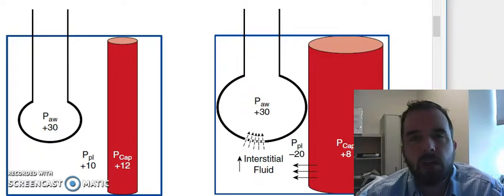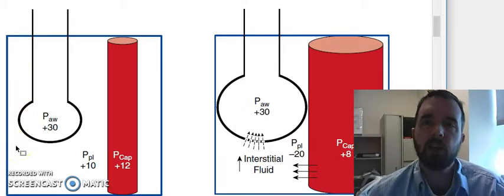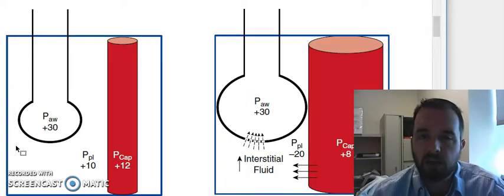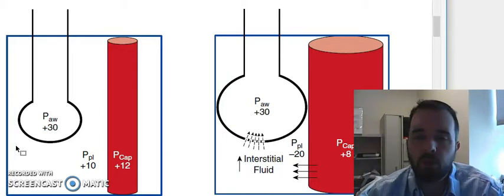I wanted to show you this concept about why mechanical ventilation is different than normal breathing. When we breathe normally, we actually suck air into our lungs. We generate a negative intrapleural pressure, okay? And air enters our lungs in that dynamic fashion where it's sucked in. In mechanical ventilation, it's a game changer because we're actually pushing air into the lungs using positive pressure.